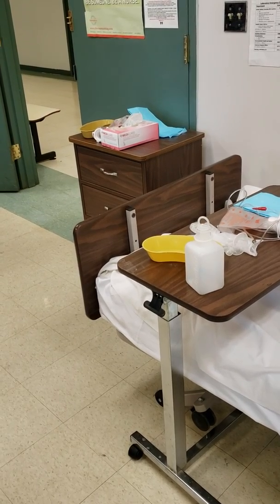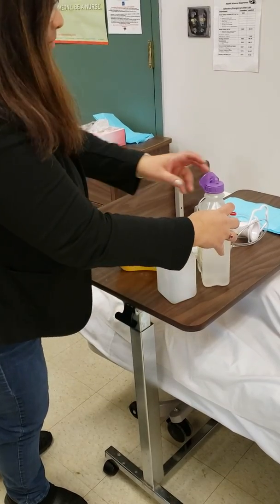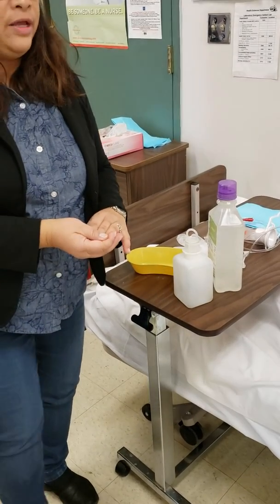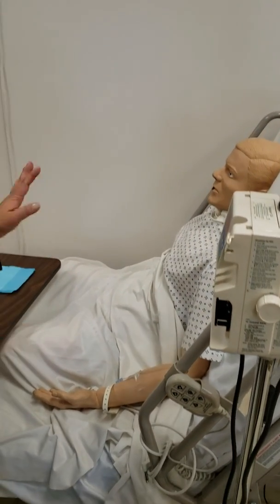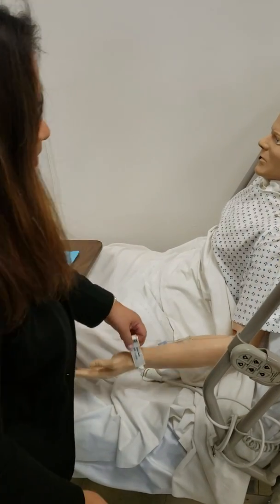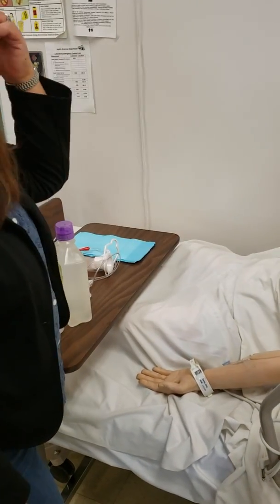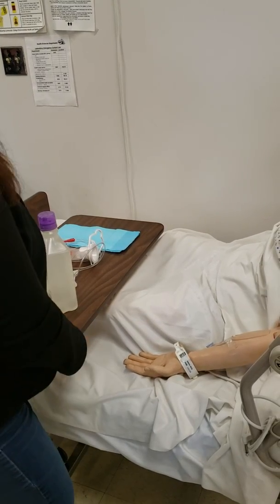So, next, these are your supplies. You go grab all of them. You're gonna wash your hands after gathering all your supplies, and then we will introduce ourselves to the patient. My name is Marlene. I'm your nurse for today. What is your name? What is your date of birth? Check the ID band. Okay, we have the barcode, so you can verbalize. I'm gonna scan the ID band. I'm here to give you your feeding.